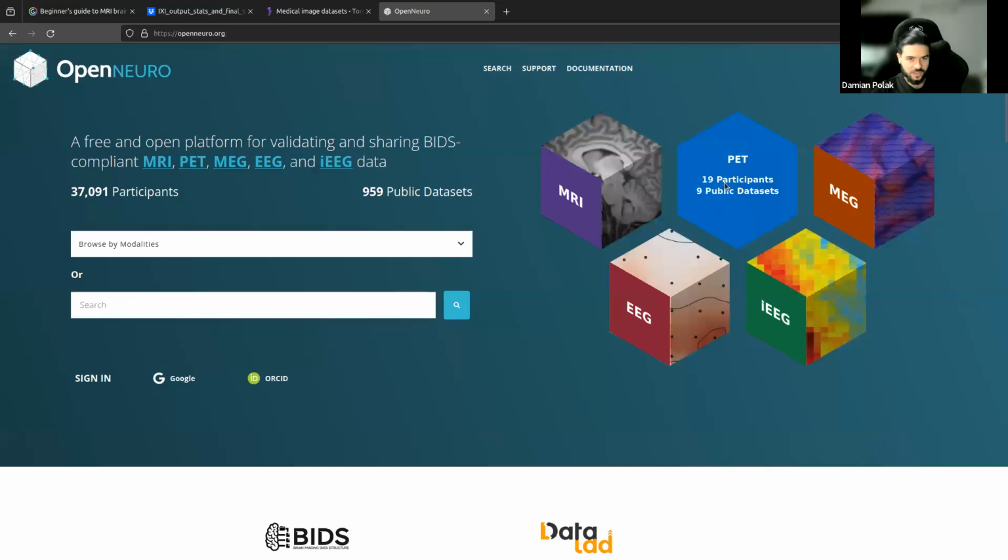Also, the PET data are available. This also goes beyond our tutorial topic, but those PET scans are also a method to image the brain, and they're also used with machine learning classification. It's another topic worth researching.